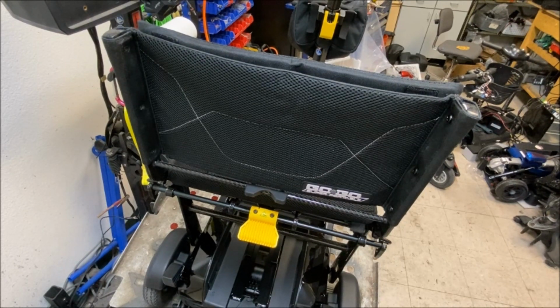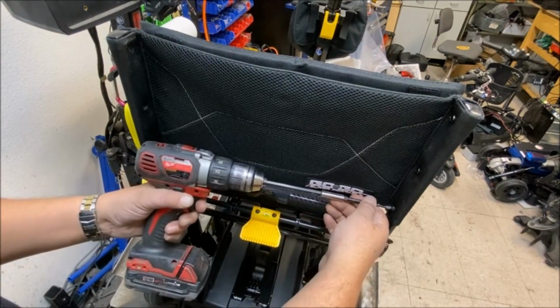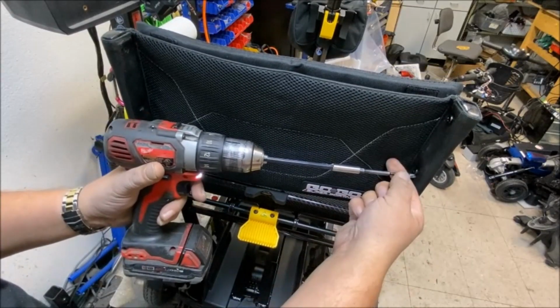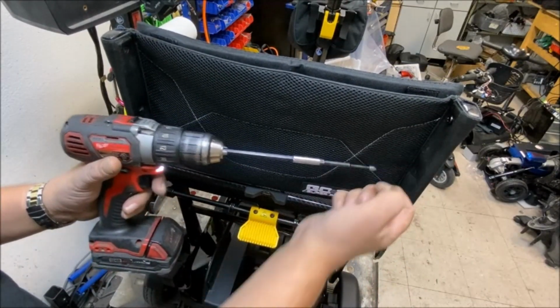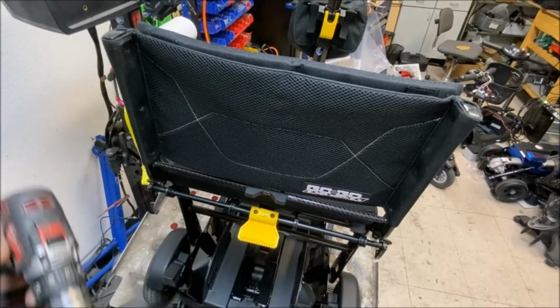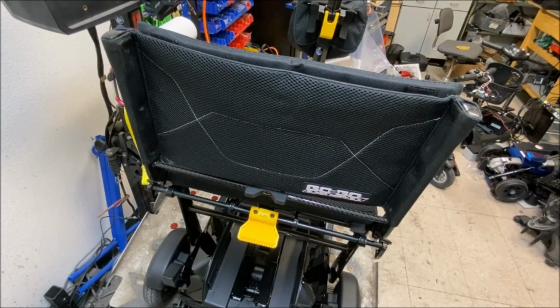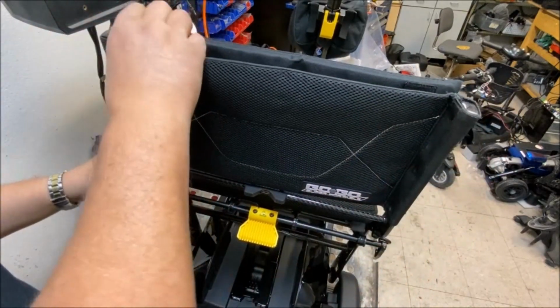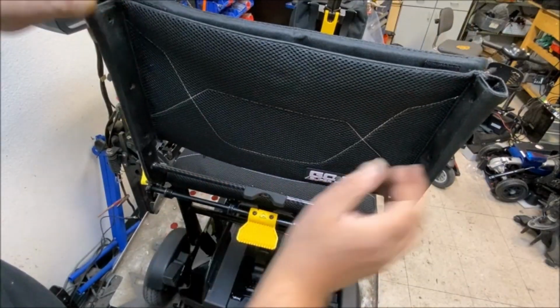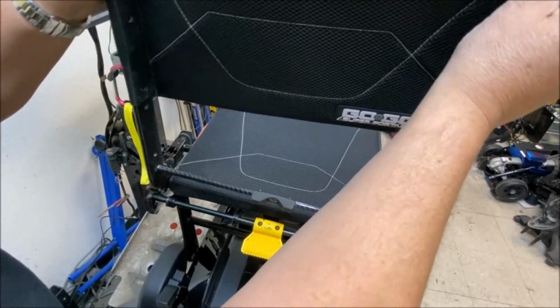So while I was messing around with that Ultra X, I'm trying putting a resistor in line with the throttle. So that's what I'm messing around with at the moment, to see if I can get it to go even slower. So that's my little pet project at the moment while I've got a bit of downtime. I don't know the values of the capacitor, the inline resistor that you would use, so I've got to do some investigating on that and see how far I can go down on speed. I've just added a capacitor, and it seemed to slow it down a little bit, but not enough. So that's what I'm messing around with at the moment.